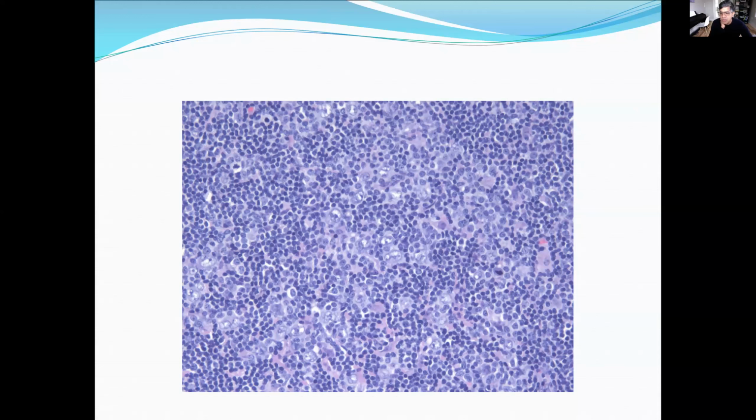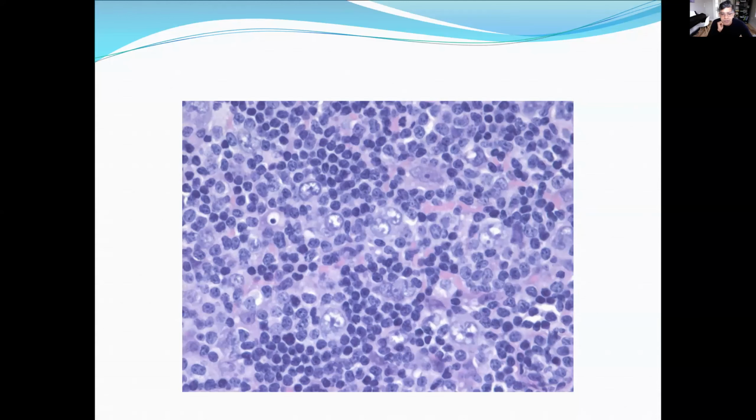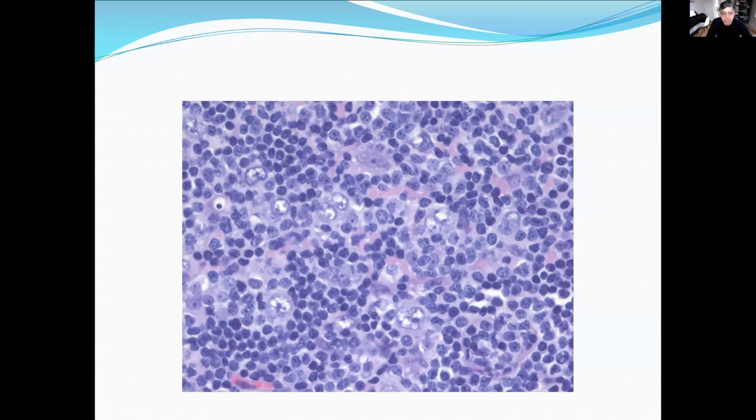Okay, let's keep looking. One more person from CMC is telling me the answers. These are folded looking cells, yeah? They have multiple folded nuclei, potato-like nuclei, with small nucleoli. And we obviously need to confirm the phenotype. So let's look at it more. I'd like to keep looking at these cells, and that does remind me of popcorn. So I hope a bell goes off in your minds, my students.